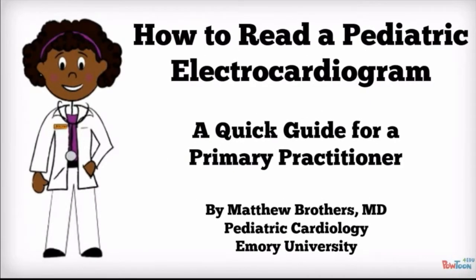My name is Matthew Brothers, Pediatric Cardiology at Emory University. My lesson today is how to read a pediatric electrocardiogram, a quick guide for the primary practitioner.